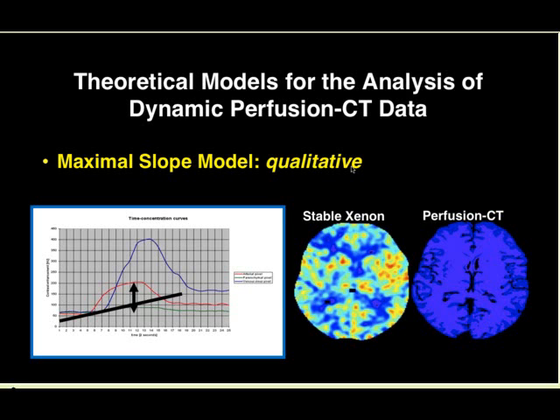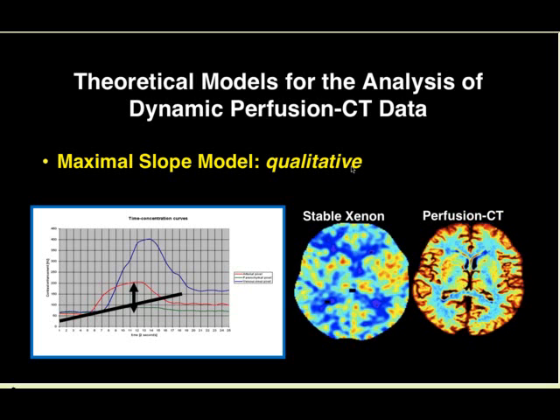Dr. Strother showed earlier those different values in the gray and the white matter. Typically, if you are measuring on those particular perfusion CT maps, you wouldn't get the same values that she reported, again, because you are underestimating those values. Now, that being said, if you window this map appropriately, you are going to have appropriate relative values. So typically, if you want to compare what's happening on the right side with what's happening on the left side, it's going to work well, because you can see what is relatively different between the two hemispheres. And typically in a stroke, since one hemisphere is going to be affected, you are going to be able to detect and characterize the abnormality.